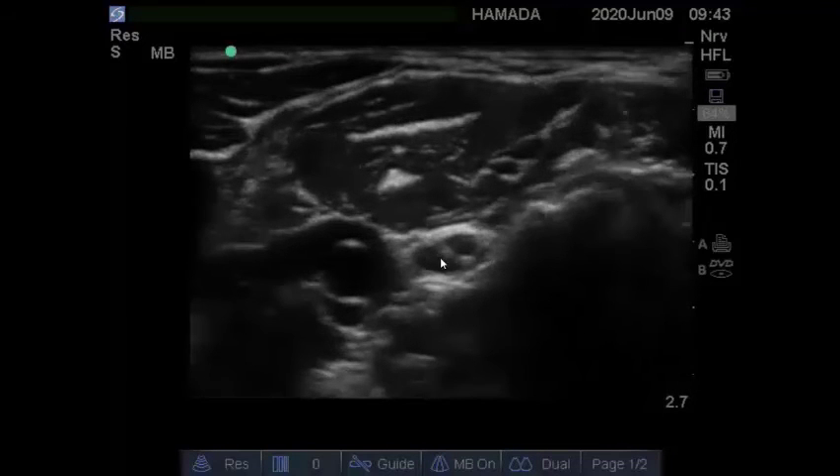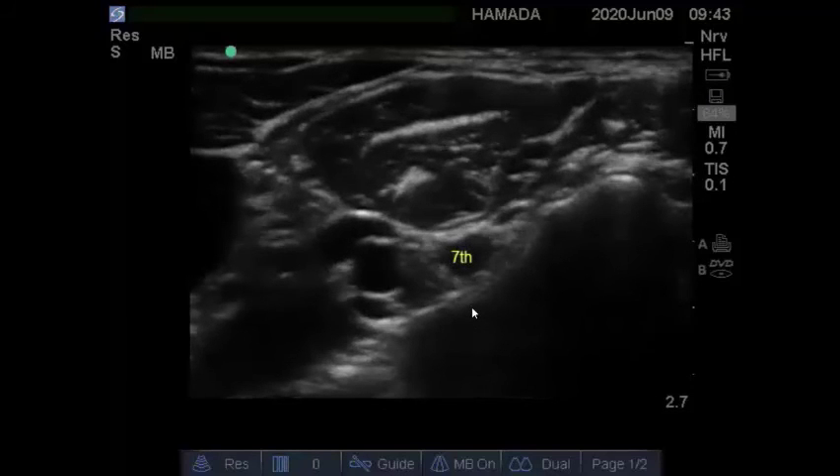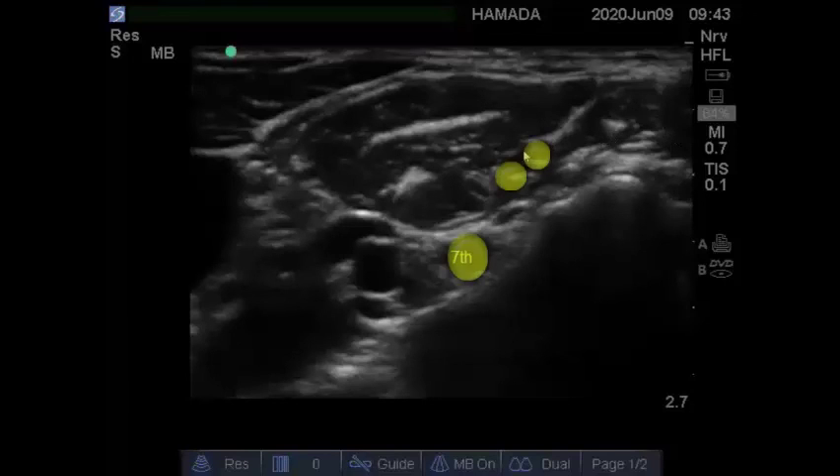This is the seventh cervical nerve root and this is the posterior tubercle. This is the slow part of the transverse process and there is no anterior tubercle. We can also see the vertebral artery and vertebral vein, and this is the internal jugular vein. This is the sternocleidomastoid muscle, this is scalenus anterior, and this is scalenus medius muscle. In between them there is cervical nerve root 5 and cervical nerve root 6. And this is the seventh nerve root again.